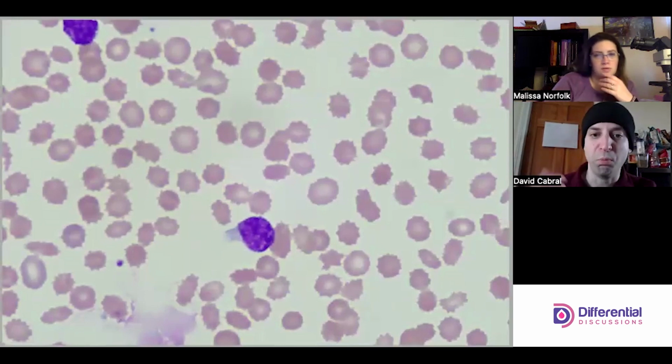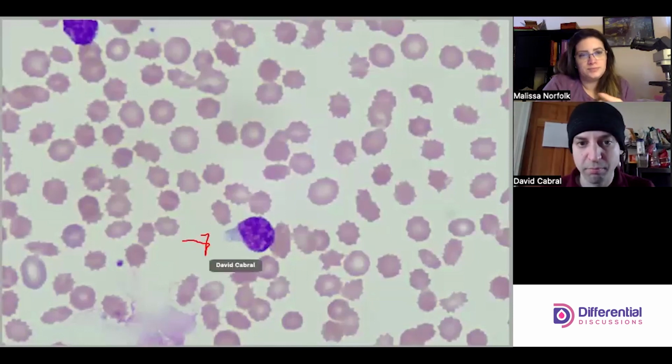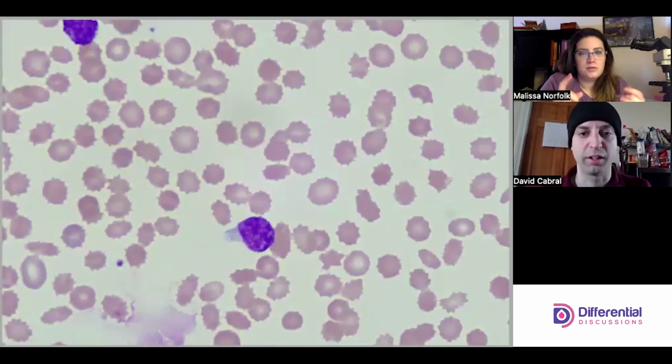I'm going to put a lot of weight on the hand mirror presentation, and the way that these nuclei are staining and those patterns. That's going to do a lot of work here. Smudgies. So you know something abnormal is going on. Some of the cells do look very blasty.